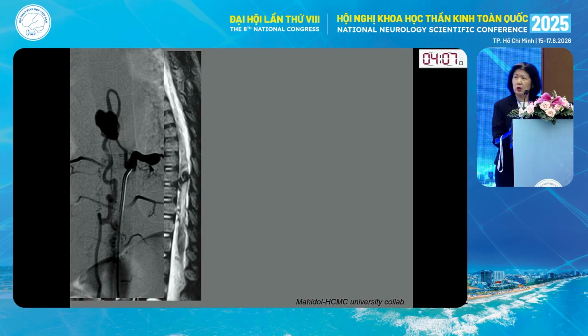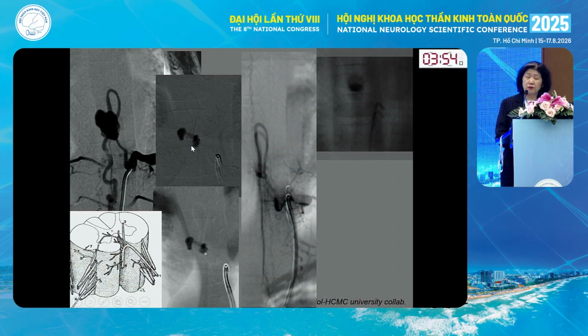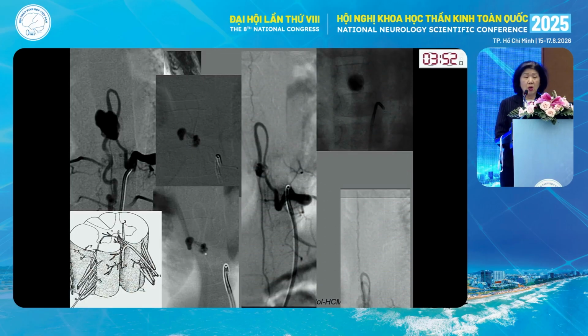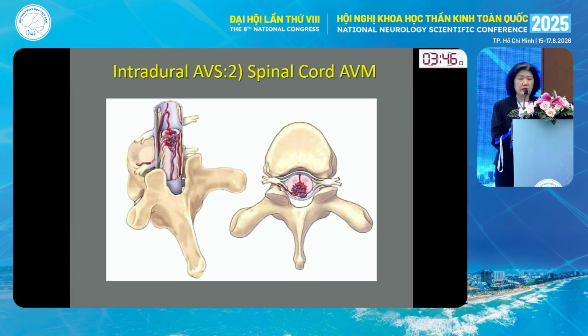We worked together with Dr. Kung for this case, and he has a beautiful illustration that with this macrofistula, we can nicely put the catheter through the sulcocommissural artery and put a drop of glue, and then later be able to get the curative result. We worked together many, many years ago.